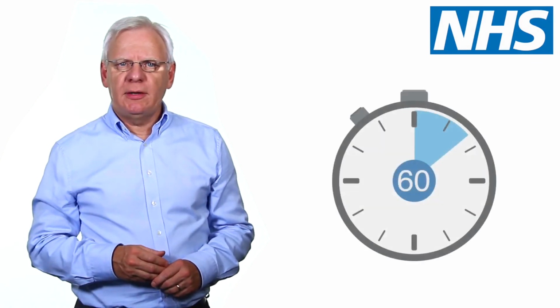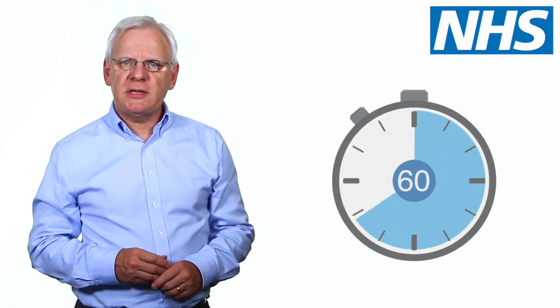If your doctor has told you to take 2 puffs of your inhaler, wait for 1 minute before repeating the whole sequence.